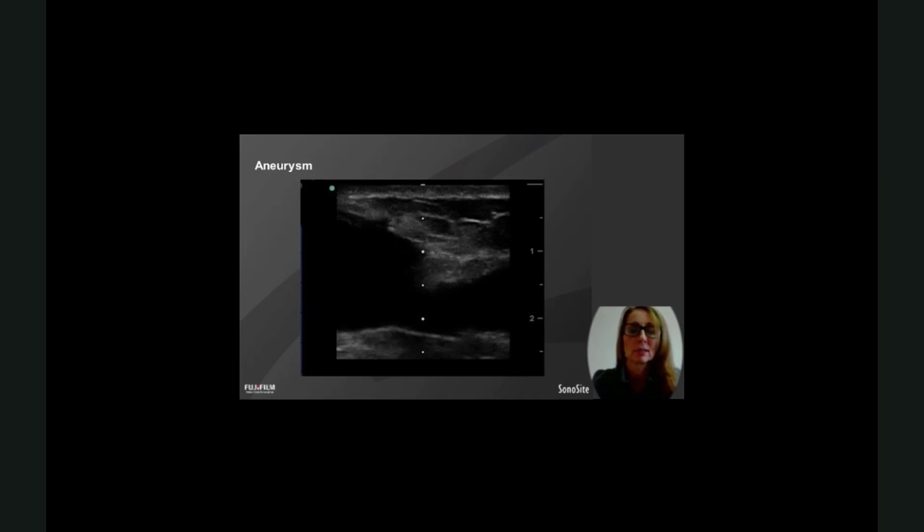So we put the ultrasound on and we could see that the segment further up where they were trying to puncture was actually 1.5 centimetres deep, and so it was just too deep for them to needle. It helped them to get a map and make a plan on the best areas where they could move around to try and minimise the area puncturing that this patient was receiving.